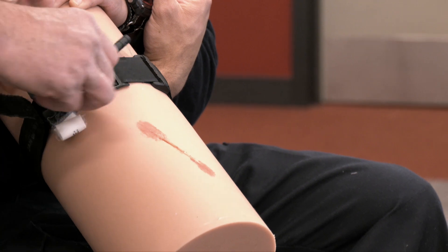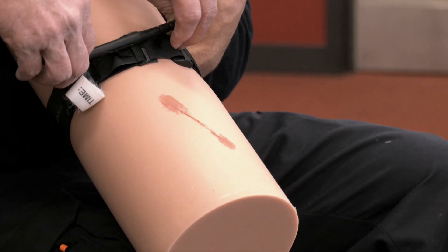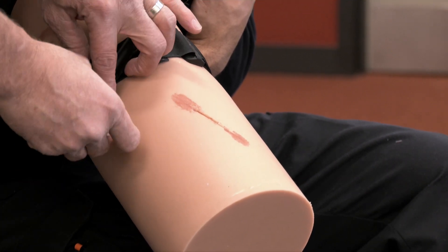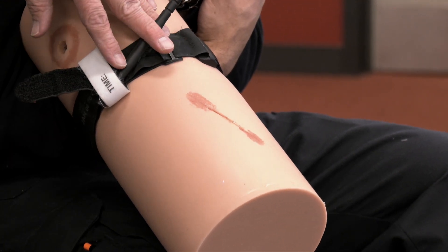Then we're going to use the windlass here — it's already attached — and we're going to twist that until we control the bleeding. Once we control that bleeding, you simply lock it in here, then take your little white tab and go right over the top. Then put the time that the tourniquet was applied.